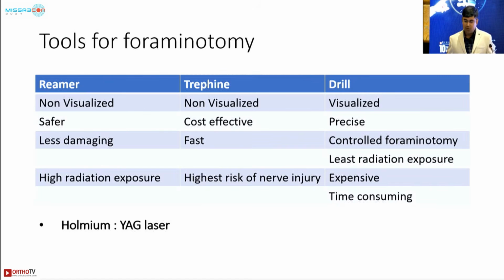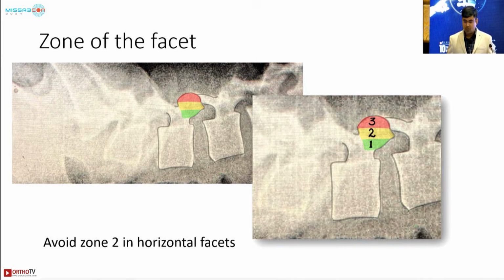So how do I do it? We have a reamer, a trephine, and a drill as options. I am more comfortable with the reamer. So this is how I do it.